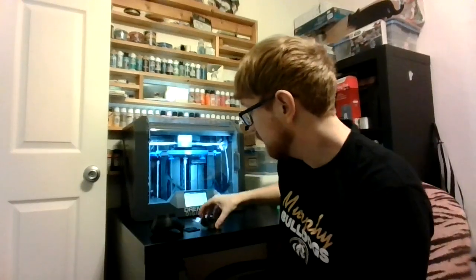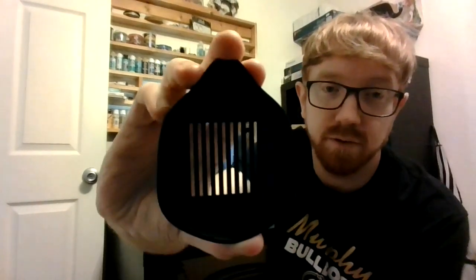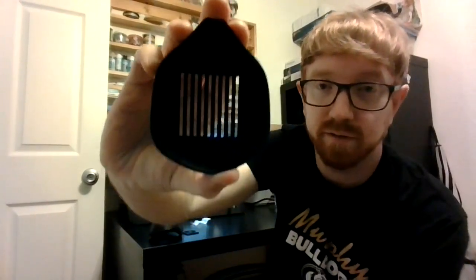And then I printed this this morning. This will help hold the filter in place. And this is the cap that goes on the outside that also helps hold the filter in place. I'm going to put this together now.